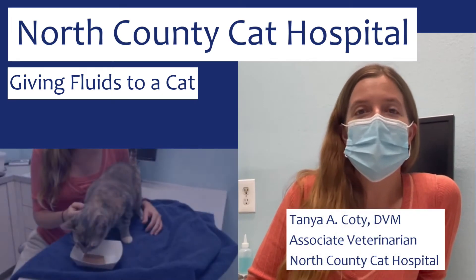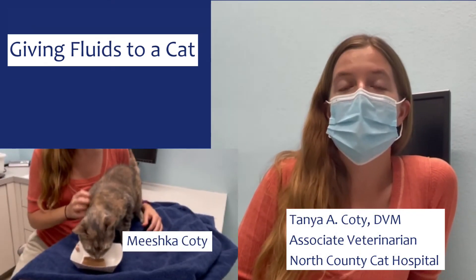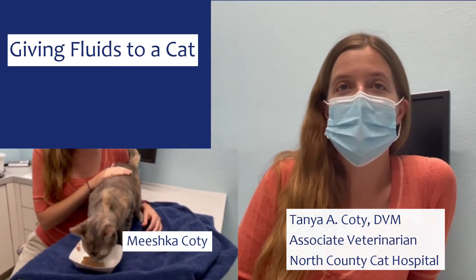Hi, I'm Tanya Cody and this is my cat Mishka. Today we're going to be showing you how to give fluids subcutaneously to a cat.